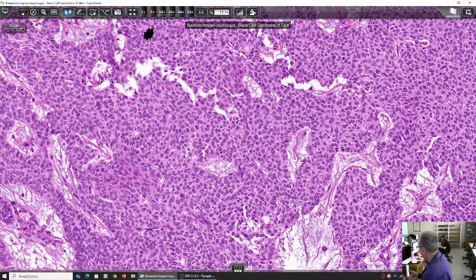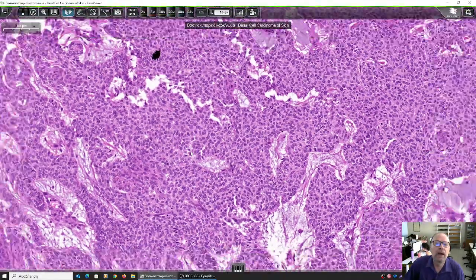So they have little cytoplasm. Which cells of the normal epidermal layers have little cytoplasm because they are somehow primitive cells, because they belong to the proliferation zone? And they proliferate all the time, and some of the cells go upwards and they get cytoplasm and they mature under normal circumstances. What cells do they look like? Basal. They're basal cells, all right, of the basal layer. That's why they're so dark staining.